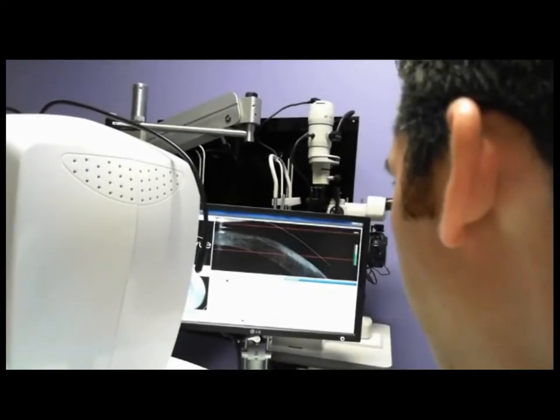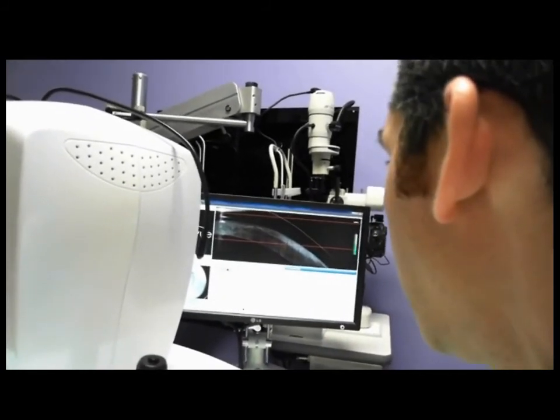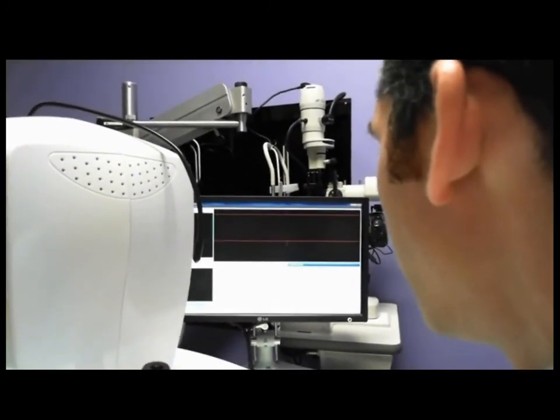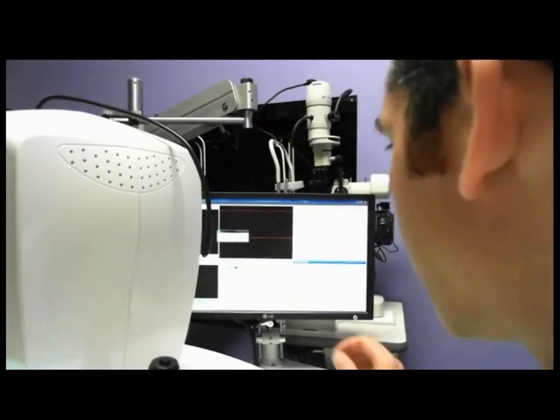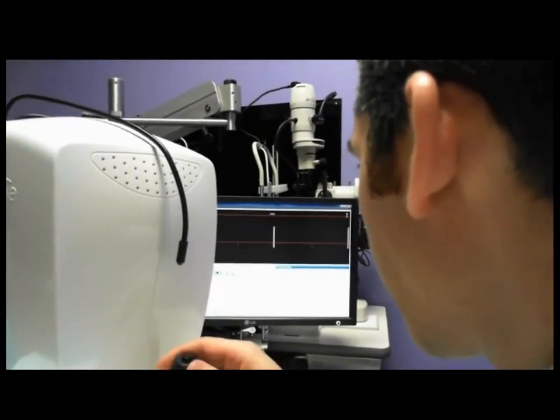Our next step from here, in terms of changing the lenses, is to make the diameter larger. We're going to increase the overall diameter so that we have more of an optic zone to work with. We may increase the vault as well to try to get just a larger sagittal depth.